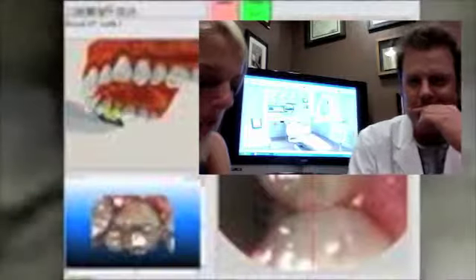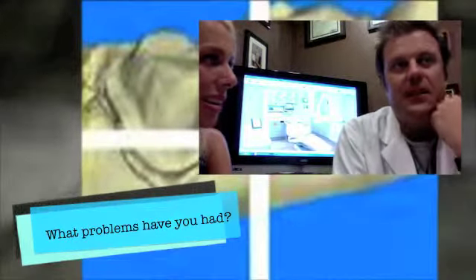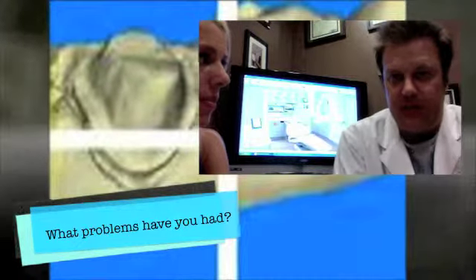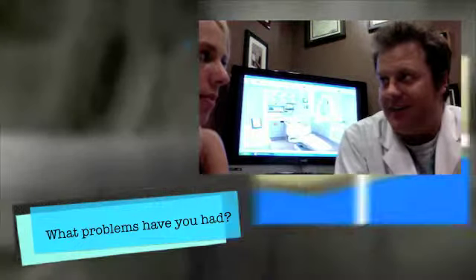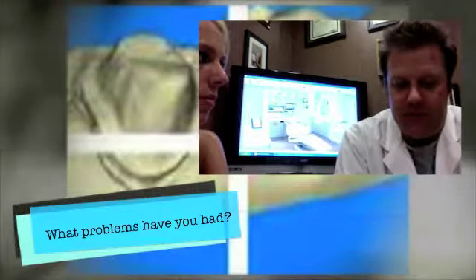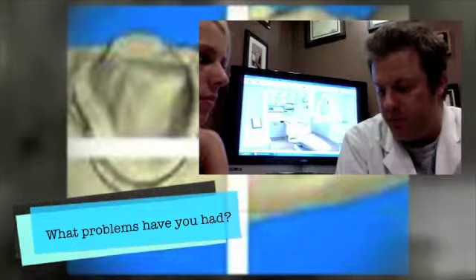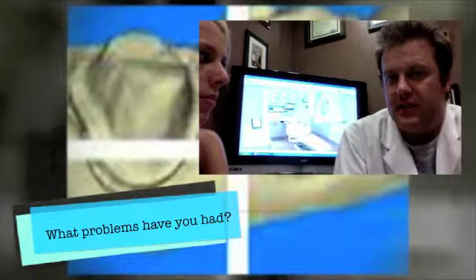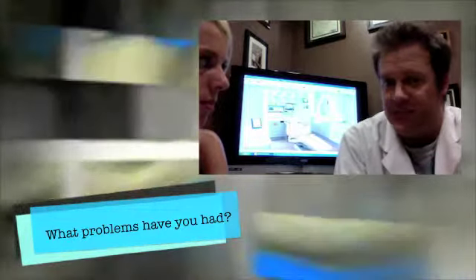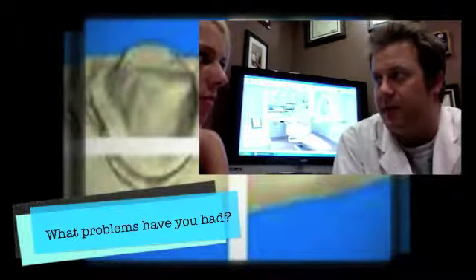And as with all new technology, what problems have you had in using this equipment? I haven't had many. It's different because I've had some of the other computer systems, the CEREC, and maybe because I did that for 5 years out of school, or even when I was in dental school, I was able to use that stuff, so I was kind of used to the camera and how to get the right angles for pictures. But since the lab makes the dental restoration, it really takes it out of my hands. I just scan it in. As long as I get a good computer scan, it's up to the lab to make the right restoration.